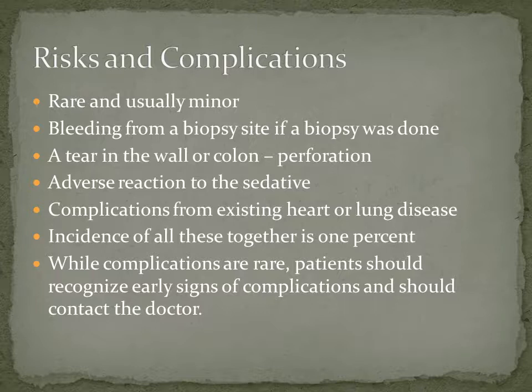Since colonoscopy is a routine procedure, complications and risks are rare and usually minor. Some rare complications include bleeding from a site where biopsy was taken or polyp or other abnormal tissue was removed, but the bleeding is usually minor and can be controlled. It is quite unusual to require transfusions or surgery for post-colonoscopic bleeding.